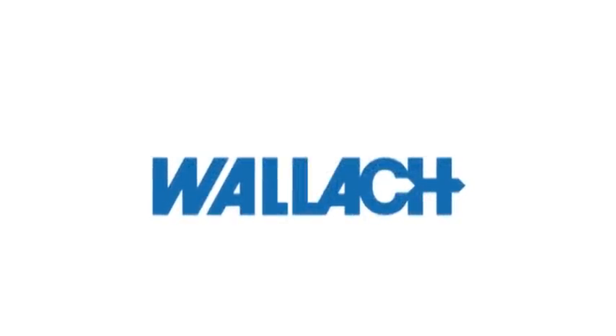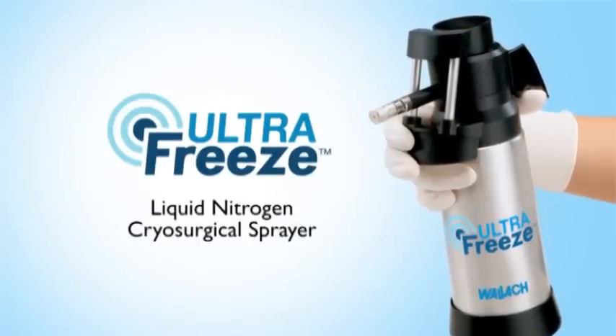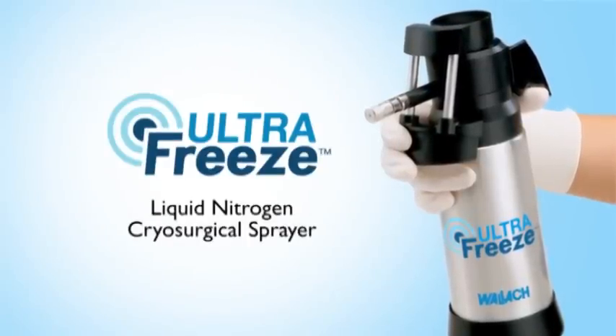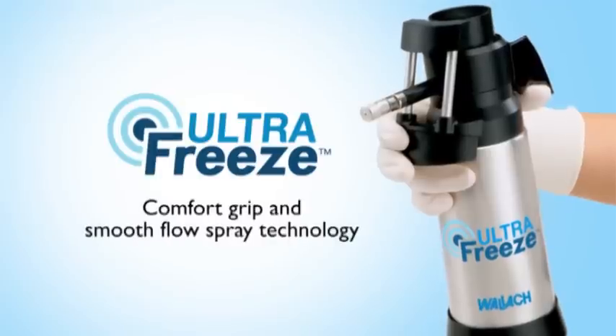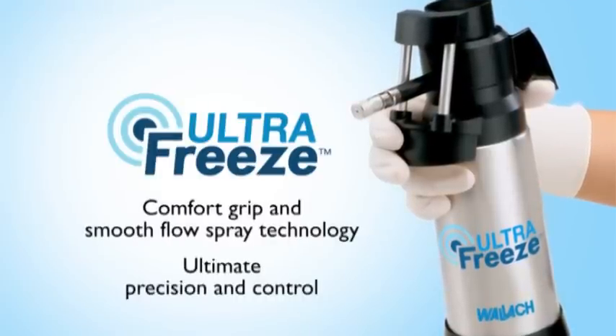Trusted by physicians for more than 30 years, Wallach products are engineered to provide enhanced safety, reliability, and performance. Wallach's UltraFreeze Liquid Nitrogen Cryosurgical Sprayer, designed for ease of use by today's busy healthcare professional, offers a comfort grip and smooth flow spray technology for the ultimate in precision and control.